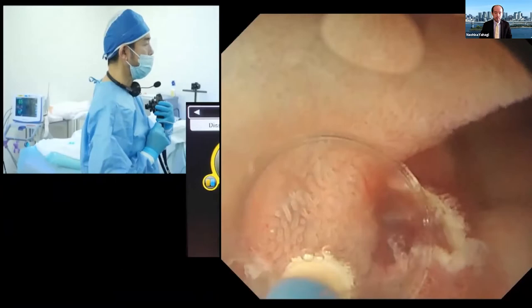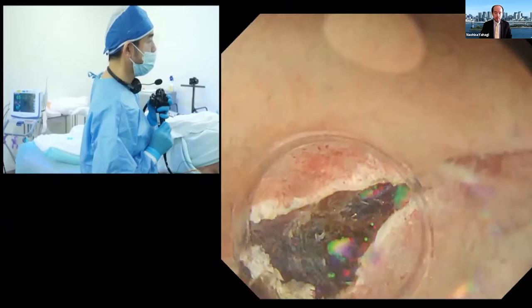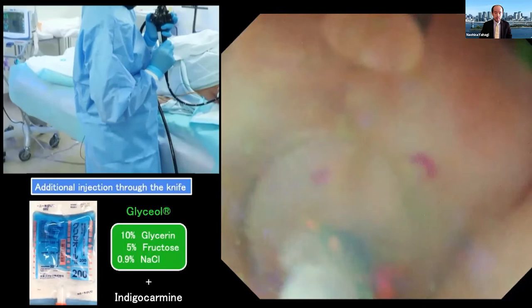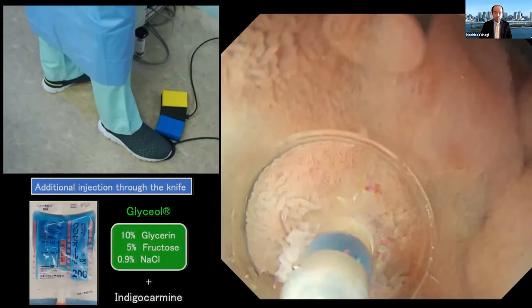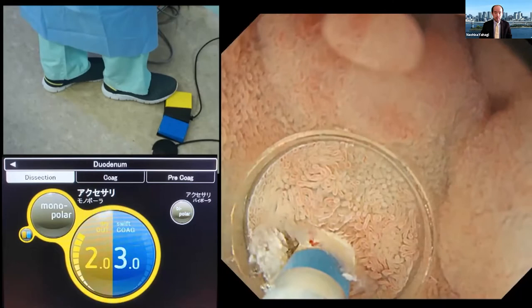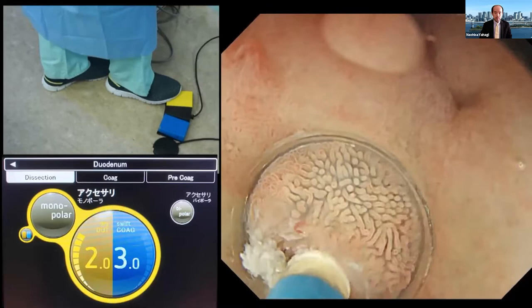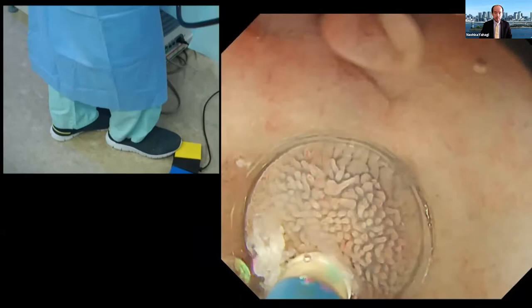I make a small hole here, inject, and it is very important to irrigate using water pressure to visualize the lumen much more clearly — otherwise it becomes blurry during further incision. Now I can connect the incision line at the lower side. It's completely connected.